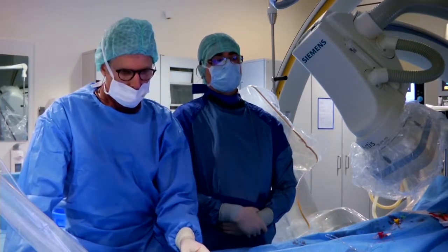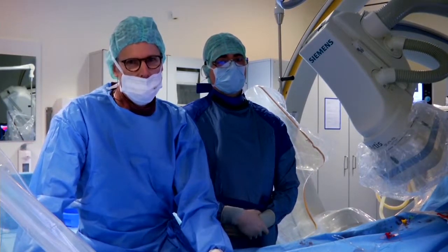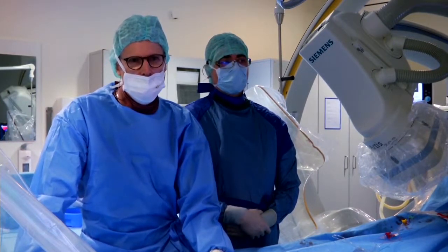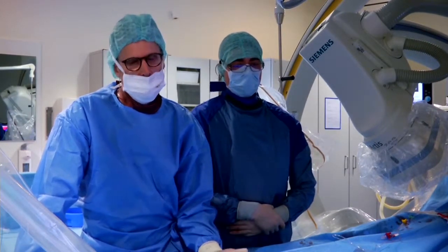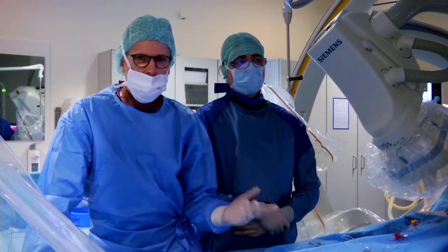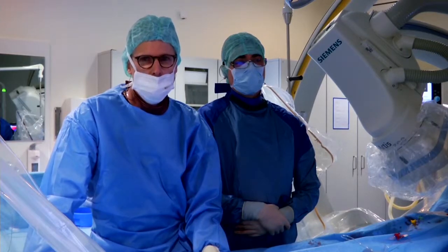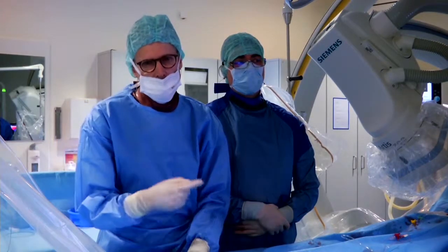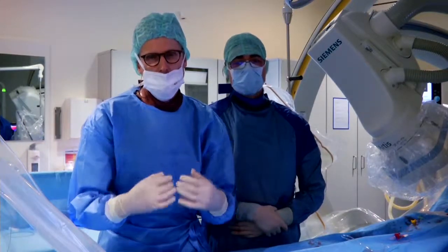Well, I share the same intuition, but we know from our bench tests that this is wrong. With the second stent inside, the fracture of the outer stent is easier because you have no foreshortening at all, and the struts are broken step by step, level by level.